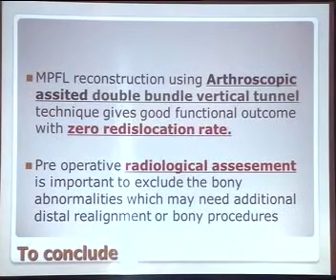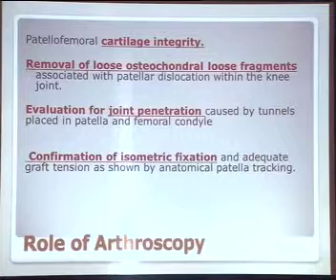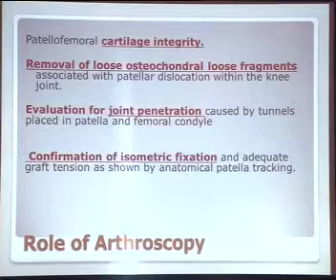To conclude, arthroscopic assisted double bundle vertical tunnel gives a 0 dislocation rate, and preoperative radiological assessment is important to exclude the bony abnormalities which may need additional distal realignment or bony procedure. And arthroscopy helps in identifying the cartilage integrity, helps in removal of loose fragments and evaluation of the joint, and also it confirms the isometric fixation and the proper graft tensioning. Otherwise, it can lead to tightness of the joint, or a lax MPFL can lead to extensor lag. Thank you for your patience.